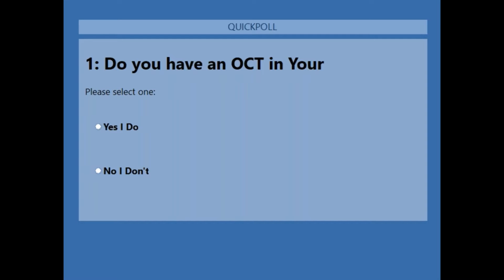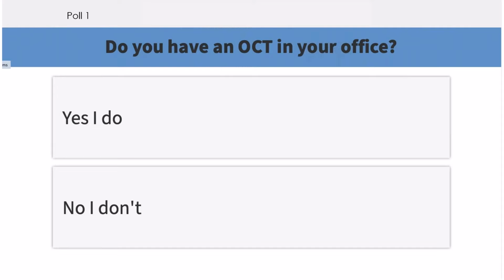Adam, let's go ahead and see the results for poll number 1 and see what the percentages are. I'll be curious to see in this audience of about 200 plus docs. Okay, so here we go. I'm going to close it, and hopefully it'll show it to everyone. If not, I can just verbally tell you. So it looks like 60% yes, 40% no. Okay, so 60% yes, 40%. So we've kind of flipped those percentages from 7, 8, 9 years ago. So more and more ODs having OCTs in their practice.